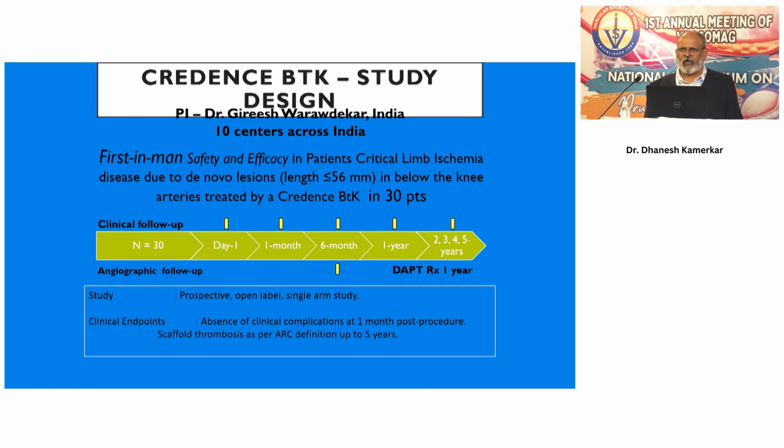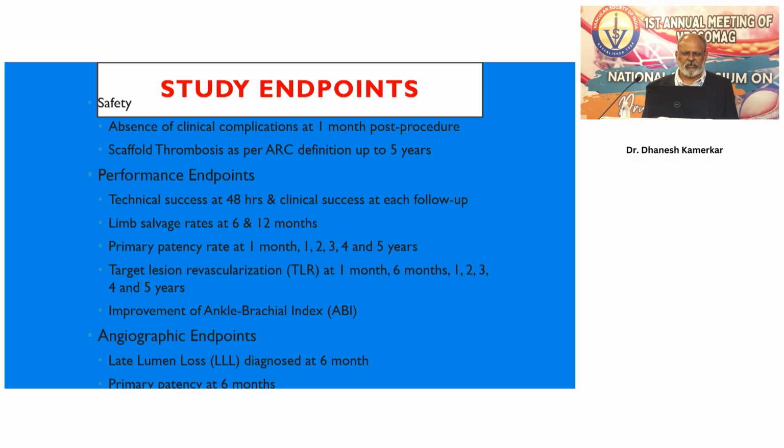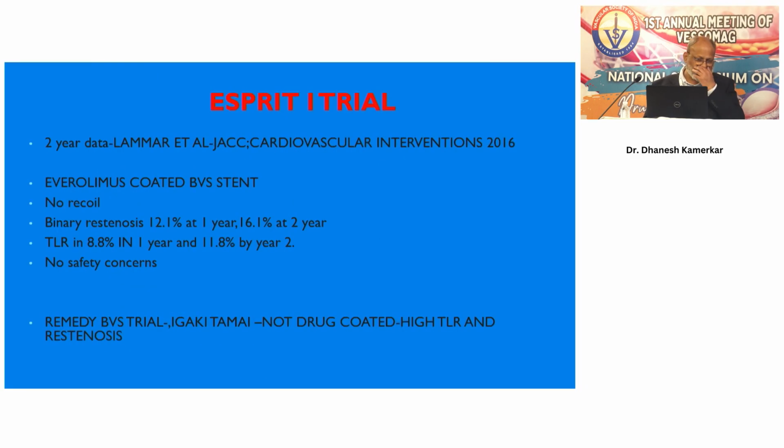Now this is a study which I was part of as a PI as well, the CREDENCE BTK study, whose major PI was Girish Varavdekar, our colleague. It is similar to the study Venkatesh presented, ESPRIT BTK, using bioabsorbable scaffolds in below the knee arteries. I think we did 30 patients. These were some of the endpoints, and the results were quite encouraging towards the end of 3 years.